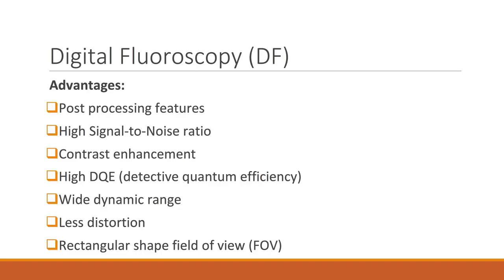Other advantages of digital fluoroscopy include a wide dynamic range, decreased distortion, and the rectangular shape of the field of view when compared to the round field of view of the image intensifier. This allows for visualizing anatomy that may have been hiding in the corners.